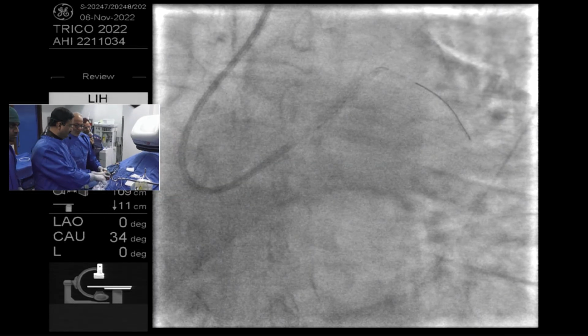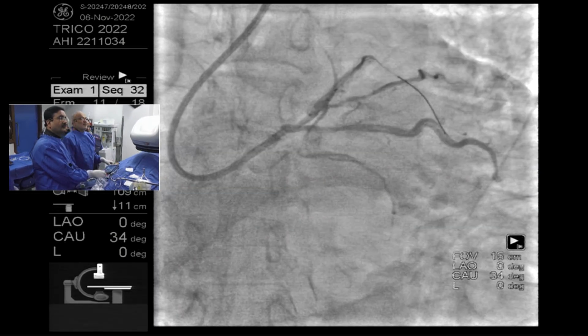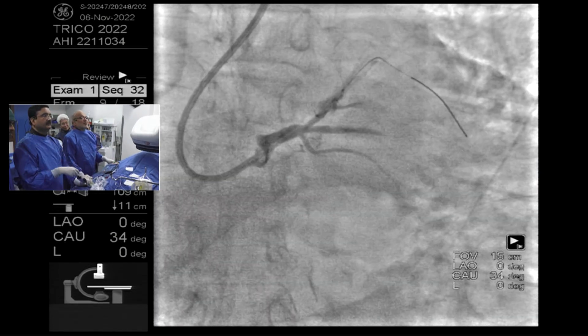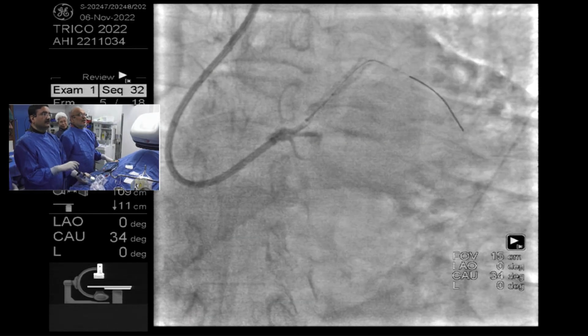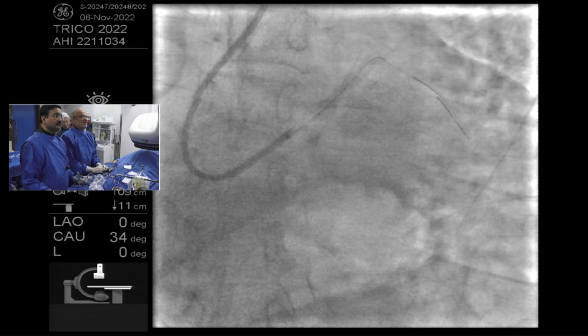Inject into the distal left main. I think we have not done it yet. I would treat that whole area, the ostium, all the way to the left main. I think so. Yep, because the rest of the vessels are very small distally.